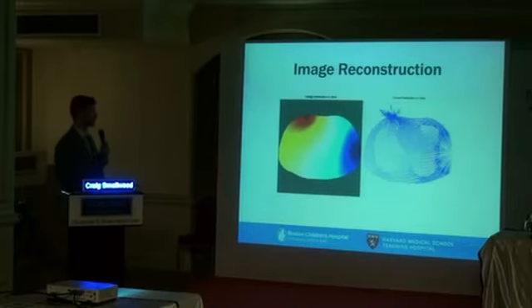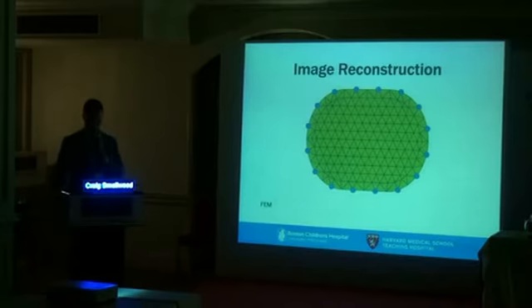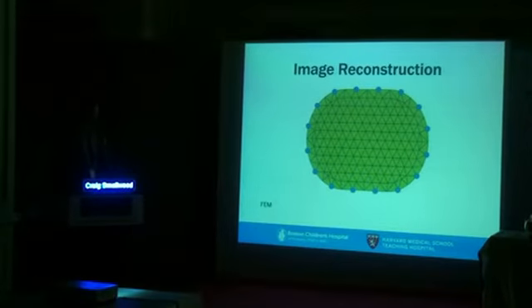And this is a simulation, basically, of what that one current distribution looks like in a subject. So we've injected some current here, and then we measure, and you can see if we measure this electrode here, we're only going to be measuring this portion of the lung, but you can imagine every time we take a new measurement, we'll eventually probe every piece of that lung. All right, so here's the cool part. So we're going to start with this mesh, and this is all in the background.